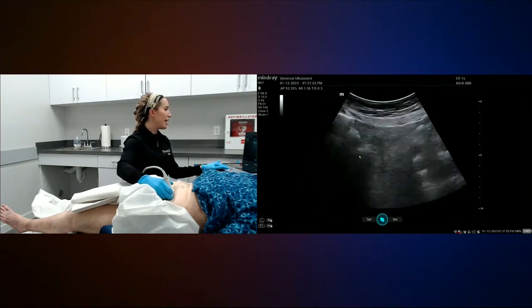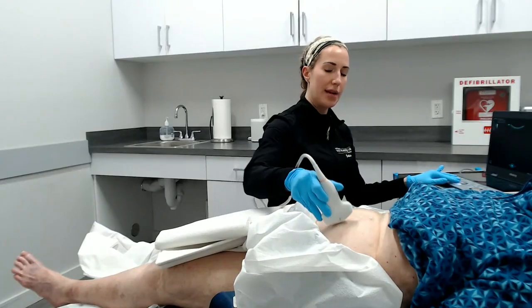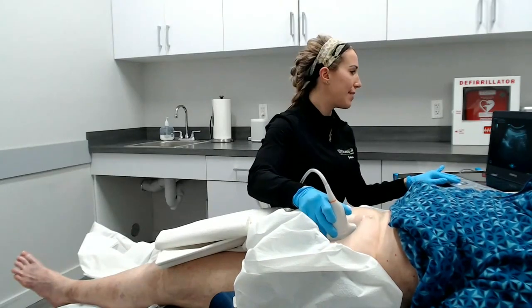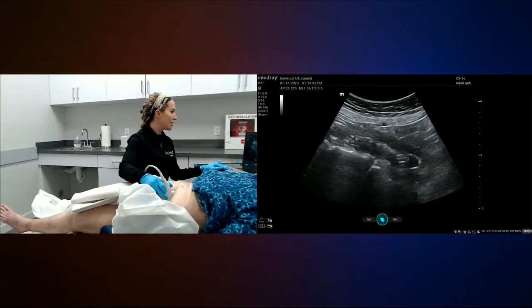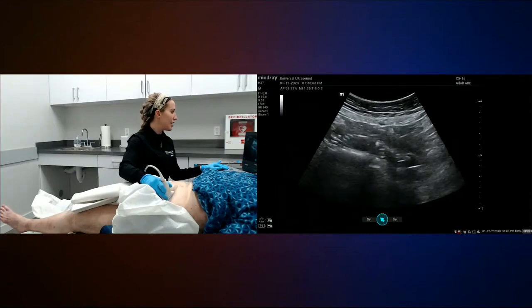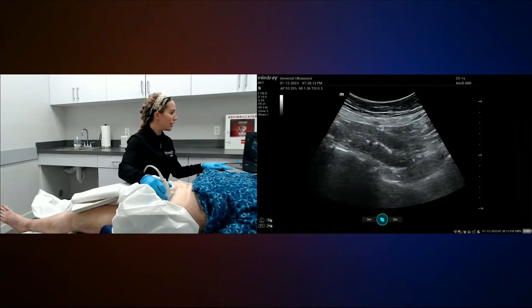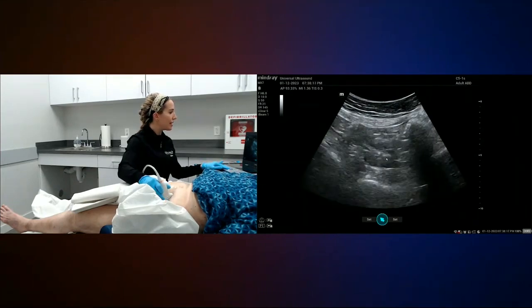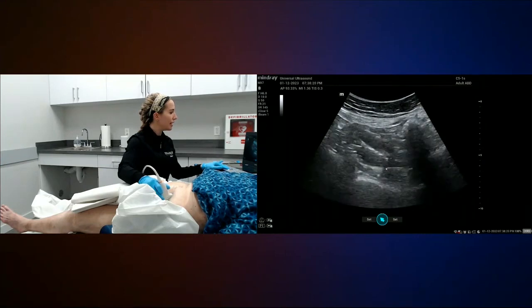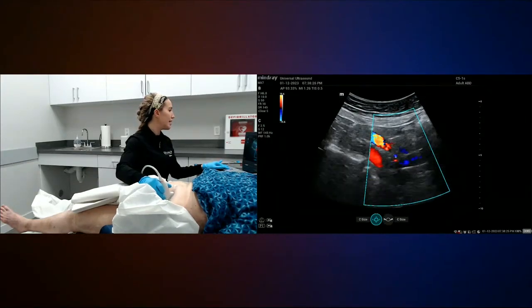All right, so now I've got a good lay of the land here. So an area of interest, right, sometimes we want to put our transducer down right parallel to the vessel, but when I do that, we have a little bit of bowel gas and we're not always able to see clearly. So I can see my proximal stent edges, which is important. This is your distal stent edges, I'm sorry. We look at this area because sometimes post-procedure this vein can spasm. So we want to make sure that that remains open and look for blood flow patency there, which we see.